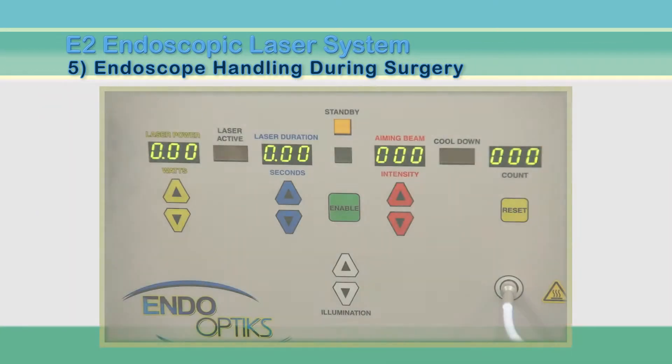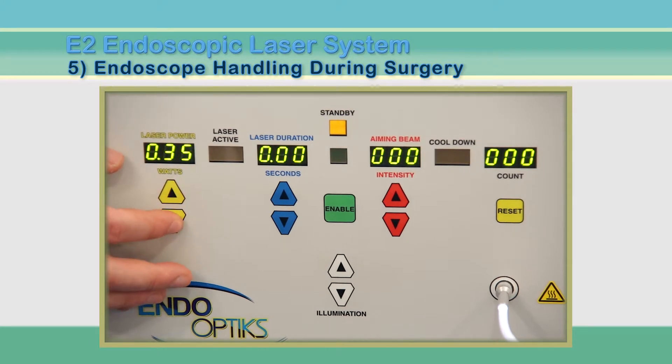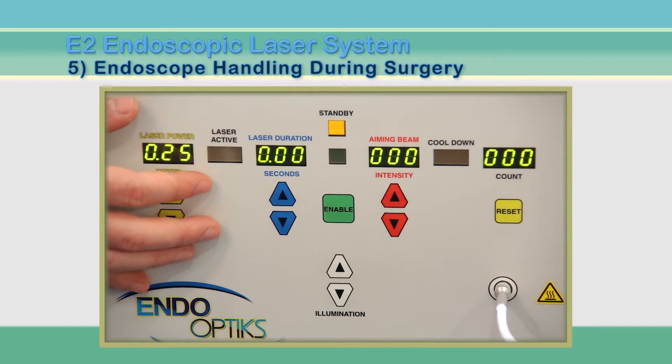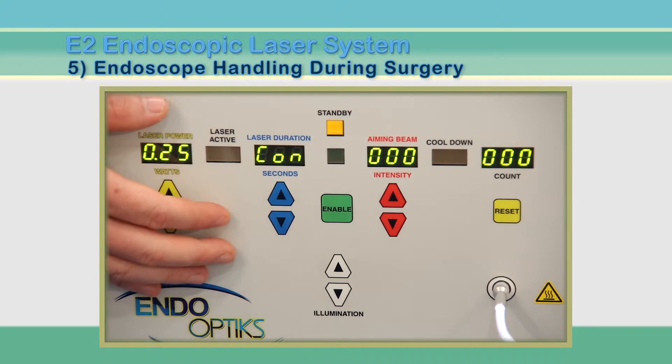Perfect focus is reached when the edge of the image is a sharp and crisp line. The next step is to set the laser parameters. Beginning on the left of the panel and moving to the right, set the laser power to 0.25 watts on the power display by pressing the up arrow. This may be raised or lowered during surgery at the direction of the surgeon. The next control is for laser duration. Depress the up arrow until the display reads CON, meaning continuous laser power is delivered as long as the pedal is depressed.